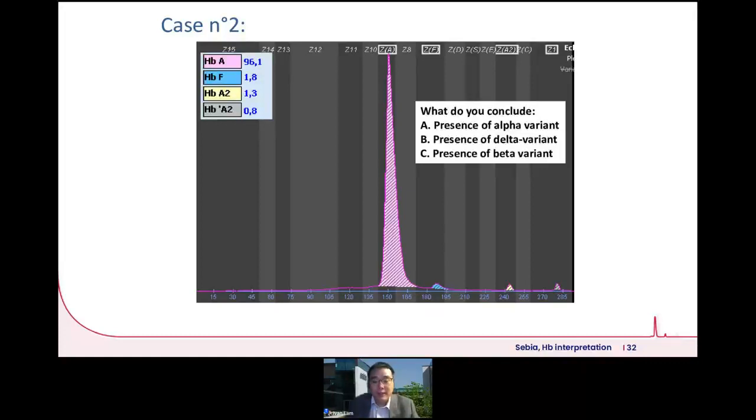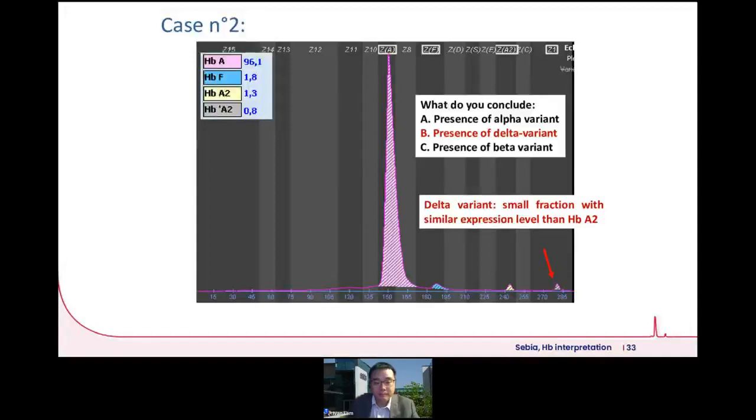So how about this case? Pretty much the main change would be the splitting of hemoglobin A2. All right. This is very likely the condition of a delta variant. So if you were to combine the two, hemoglobin A2 and the variant delta peak, it will be about 2.1%, so it still falls within a very normal range of hemoglobin A2. The true hemoglobin A2 values are relatively normal.